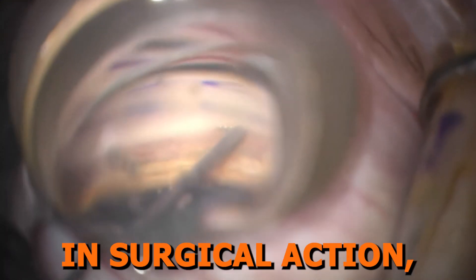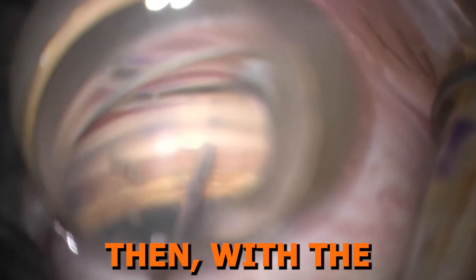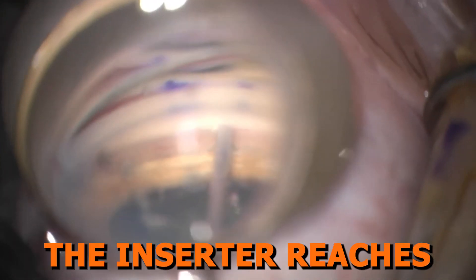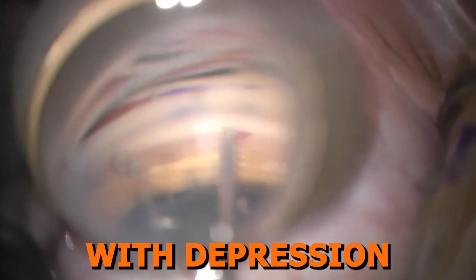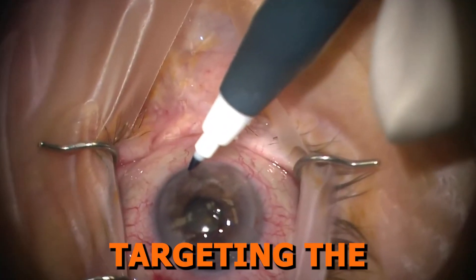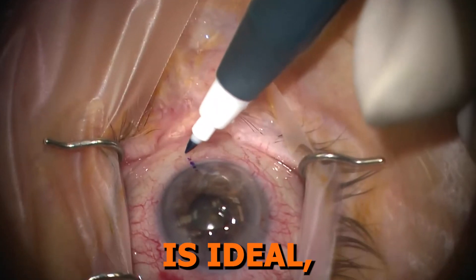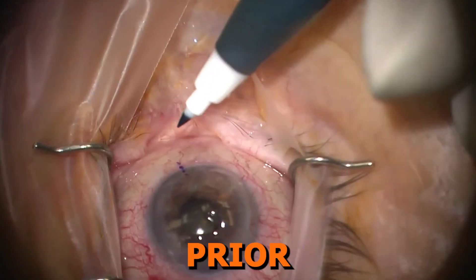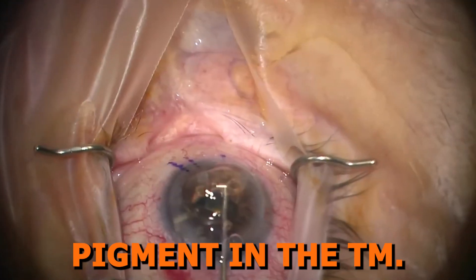The insertion of the tip through the TM into Schlemm's canal, then with the twisting of the wrist, the inserter reaches a perpendicular position, and then with depression of the inserter button, the device is released. In order to maximize the chance of outflow, targeting the insertion near a prominent episcleral vessel is ideal, so they can be marked prior and often correlate with areas of increased pigment in the TM.